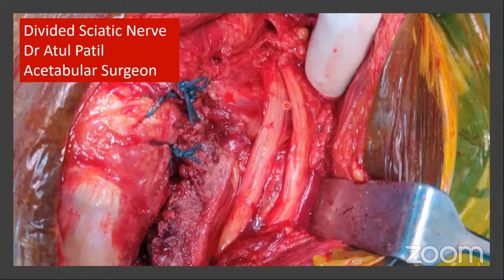So I think Ganesh, the other day I demonstrated the intercostobrachial nerve. Avinash was there and Nitin was there. And you said that the nerve looks bigger. So that was really an intraneural injection of the intercostobrachial nerve, what we did. Yes, that was inadvertent, and so I withdrew the needle tip and then injected around it. You got it that day?